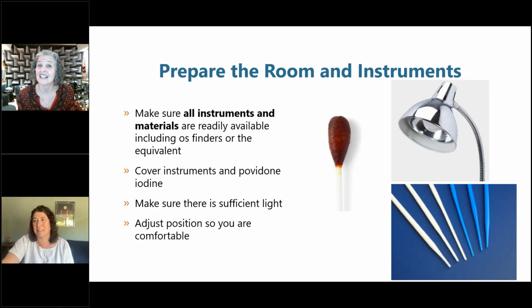And I will say that it's actually a rarity that somebody has every single thing they might need right there in the drawer, and even a second set in case they were to drop their tenaculum, they have another one ready to go. I think that the impact on the client is really underappreciated.